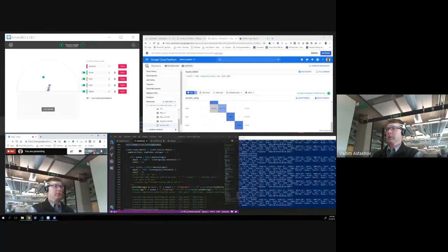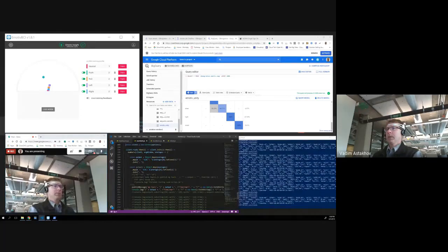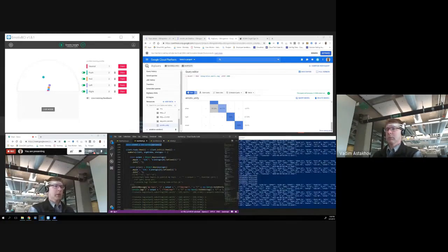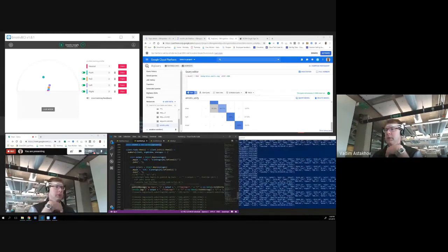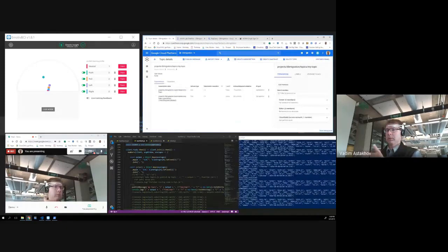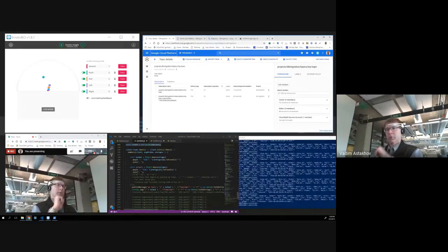As you can see on the right-hand side, I'm currently running the program that I wrote in Node.js, and I'm using the API provided by Emotiv, which is called Cortex. Using this Cortex library, I'm currently intercepting signals from the electrodes and pushing the signals into a Google PubSub. So I created a Google PubSub, and currently, when I'm literally talking and thinking, all my signals are collected and pushed to the PubSub using this Node.js script running on my laptop.